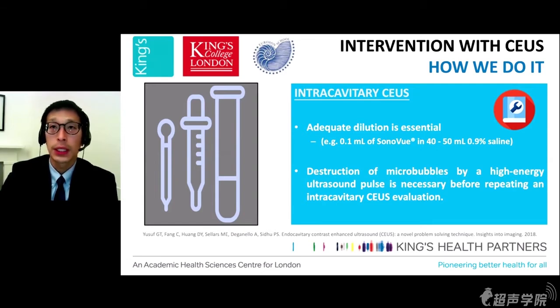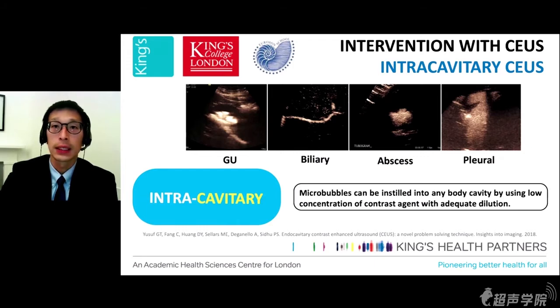So where can we use intracavitary ultrasound? In fact, microbubbles can be instilled into any body cavities, either pathological or physiological.